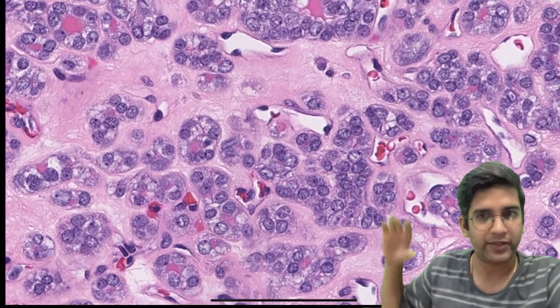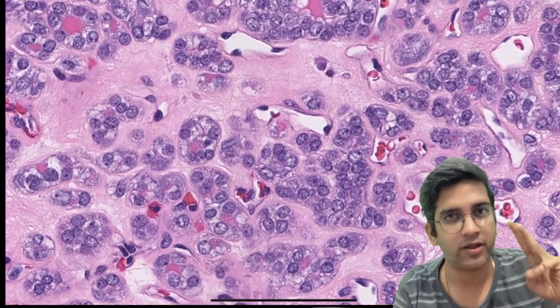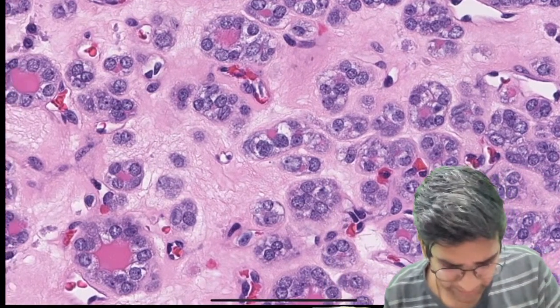It definitely has crowding, right? It definitely is overlapping, which means one of the three scores is sorted, right? The first score was size and shape. Definitely has crowding and overlapping. By default, I do have a little bit of nuclear enlargement as well, right?